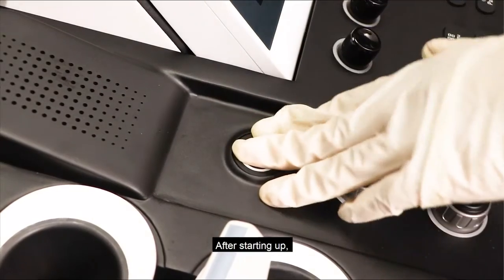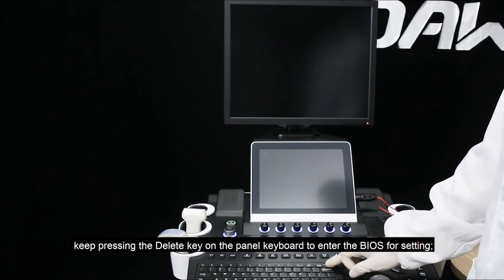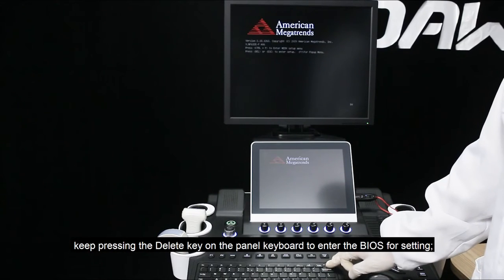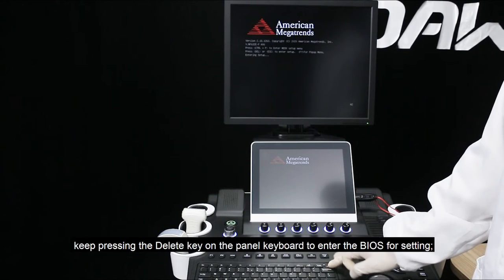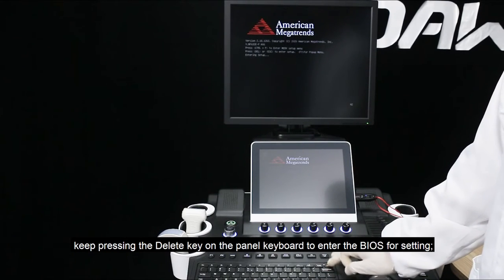After starting up, keep pressing the delete key on the panel keyboard to enter the BIOS for setting.